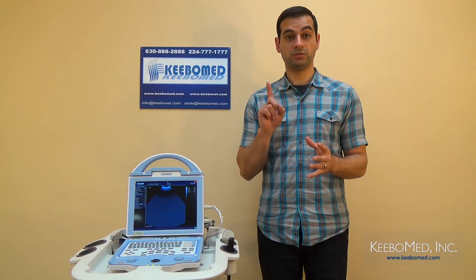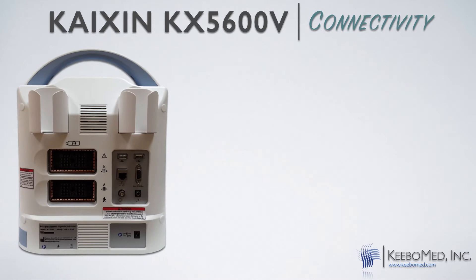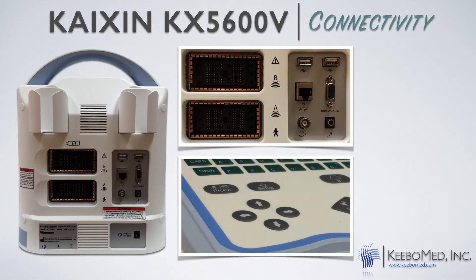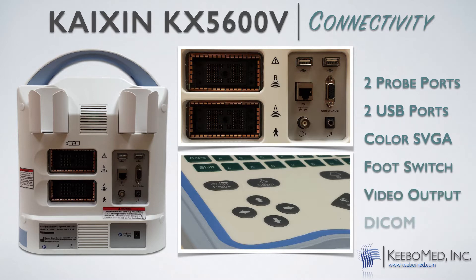Now let's take a look at the connectivity options of the KX5600. First, it has two probe connectors standard and can be quickly switched from one probe to the other with just the touch of one key on the keyboard — many ultrasounds include only one probe connector. It has two USB ports, a color SVGA output, a foot switch port, and a video output port. What makes this ultrasound really unique is that it also includes a DICOM port for network connectivity as standard, whereas many ultrasounds offer this as an option only.